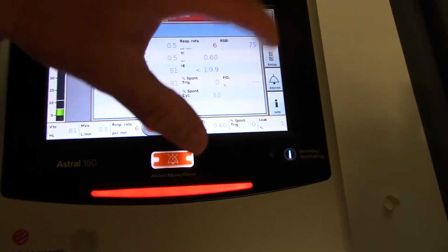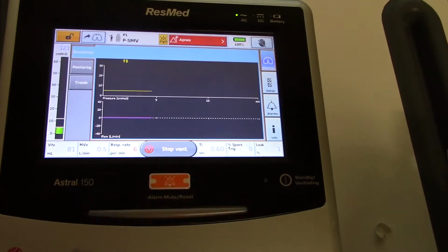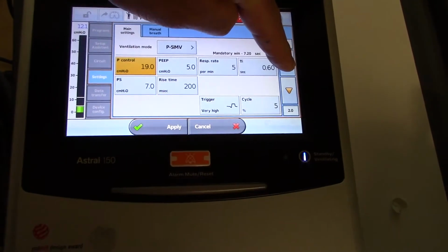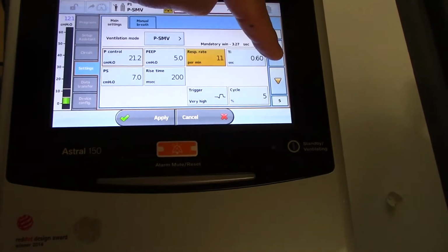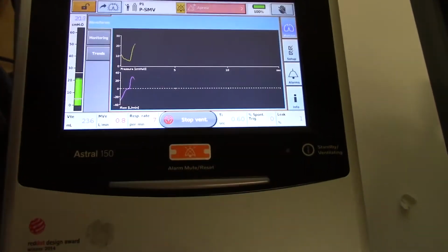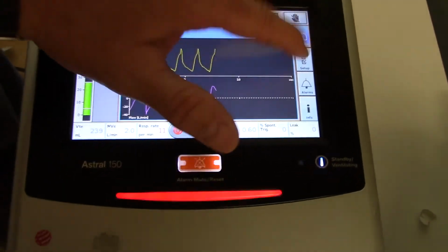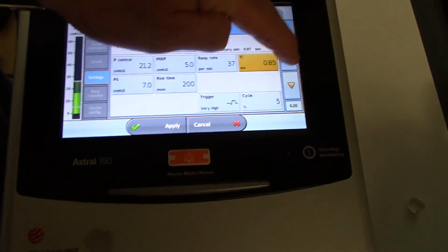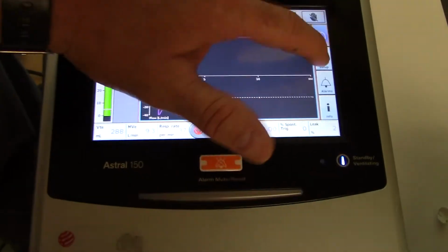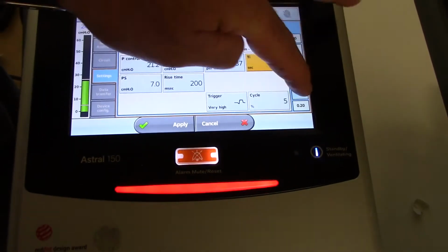Over here you have your waveforms. You're going to monitor your waveforms just like you do on the servo. You're going to look at everything like you would in the servo. Let me put some settings in here. All right, accept, and I'm monitoring. I'm looking at my waveform. You can see here that my I time is not long enough because I'm not going to zero flow. So in my normal practice, I would go up on my I time until that happens. Again looking at my waveform, the same practices that we do currently with the servo, we will do here.